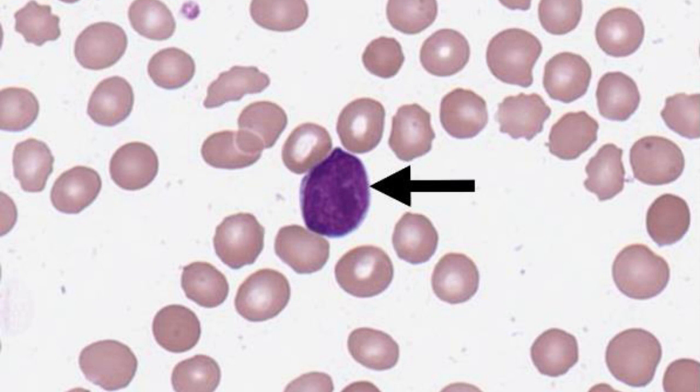In addition, reactive lymphocytes are characterized by their wide range of morphologic appearances within the same blood smear. In contrast, while lymphoma cells can exhibit a wide range of morphologic appearances, any individual case of leukemia or lymphoma, such as lymphoblastic leukemia, tends to show a more monotonous population of the cells.